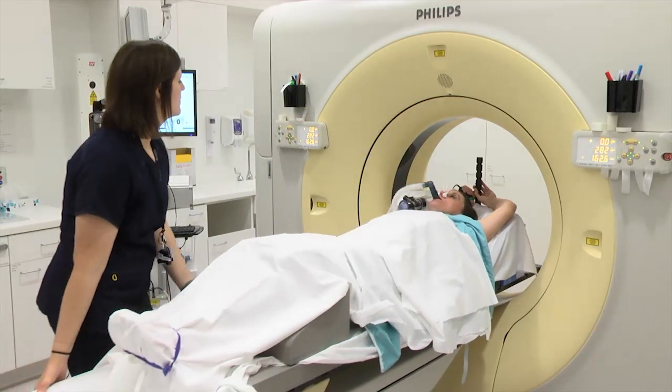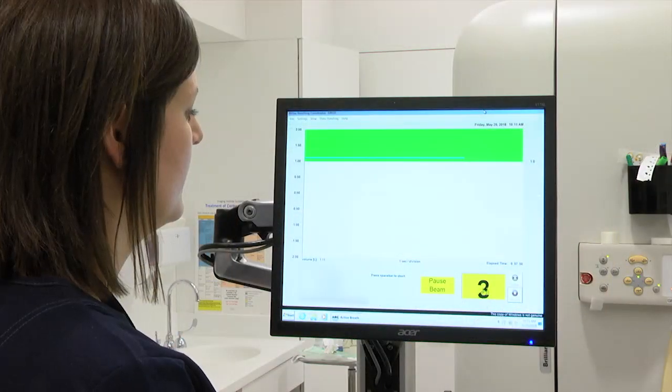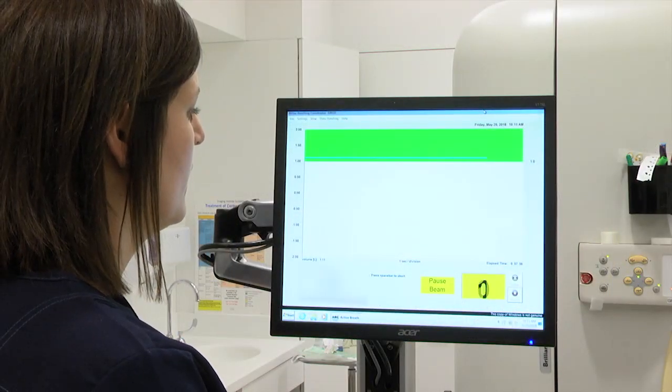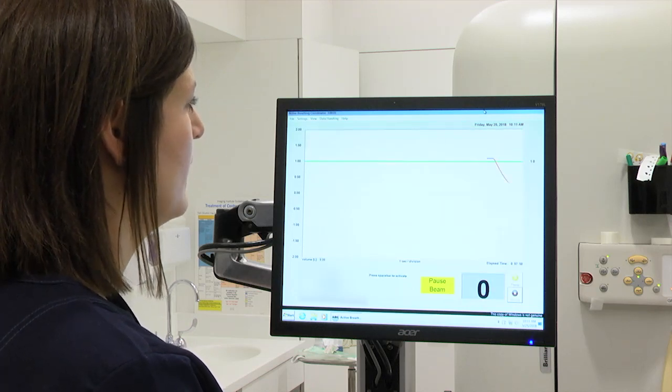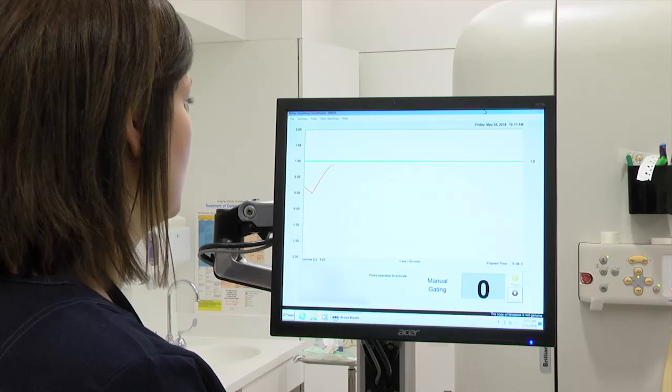The ABC device will automatically hold your breath and keep you from exhaling. The CT scans will be taken while the ABC is holding your breath. Once the preset breath holding time is reached, the ABC device will be deactivated so you may breathe normally. Your therapist will also instruct you to do so.